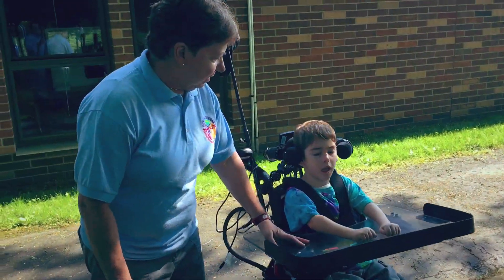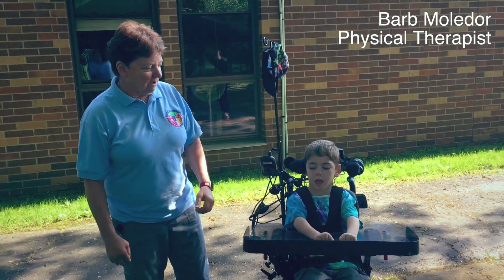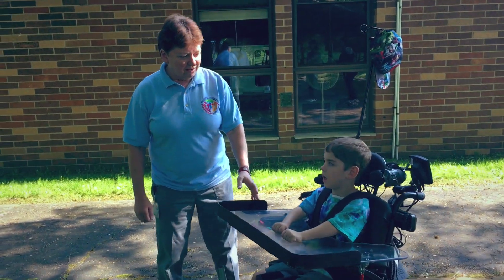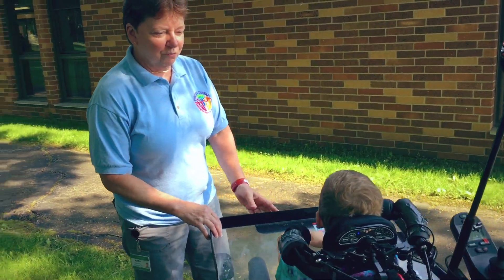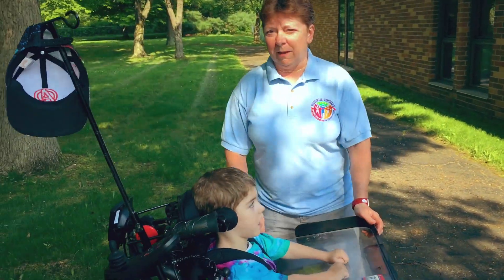What we started out with is with the headpads flipped to the side, so we're just working on going forward and learning that whole concept of stop and go on command — because that's a really important thing. It's really important for Paxton to be able to get to and from his classroom and the front of the school to get on the bus in a set amount of time.